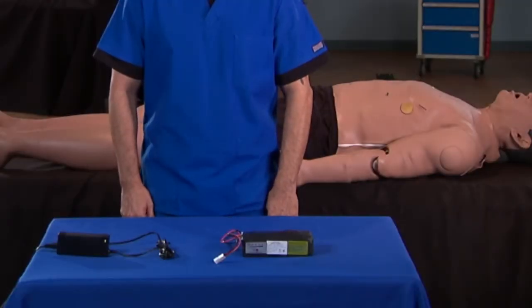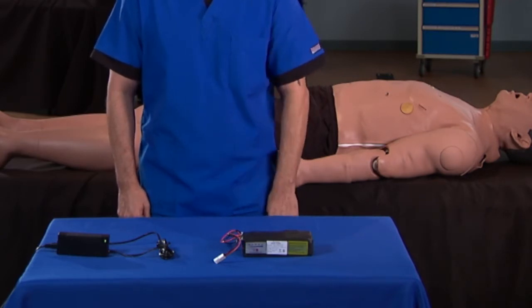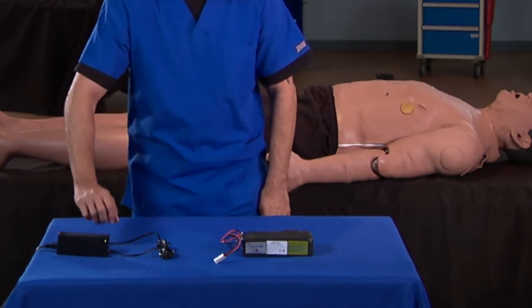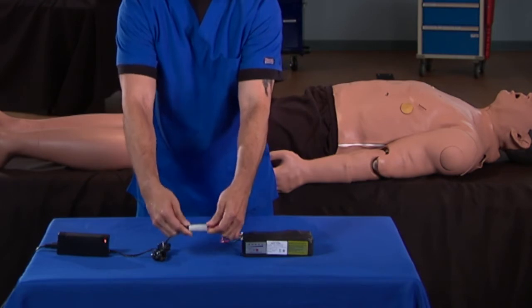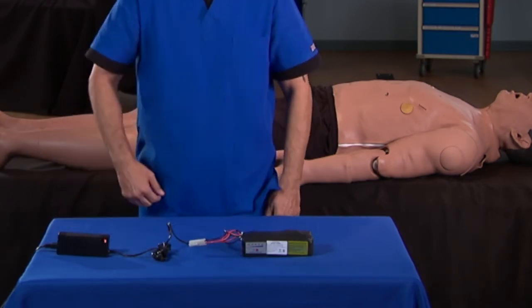Do not charge the battery while it's still in the simulator. To recharge the battery, first remove it from the simulator as shown in this video. Plug the battery charger into an outlet. When the light on the charger turns green, connect the female connector from the battery into the male connector of the battery charger. The light on the charger turns red to indicate the battery is charging. It takes approximately 4 hours to recharge the battery.